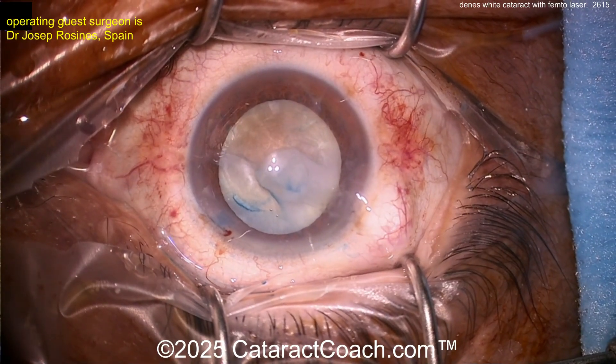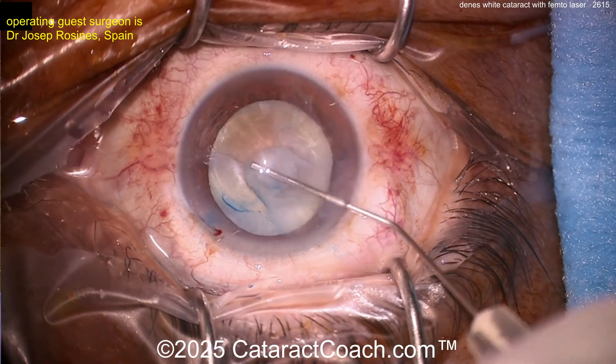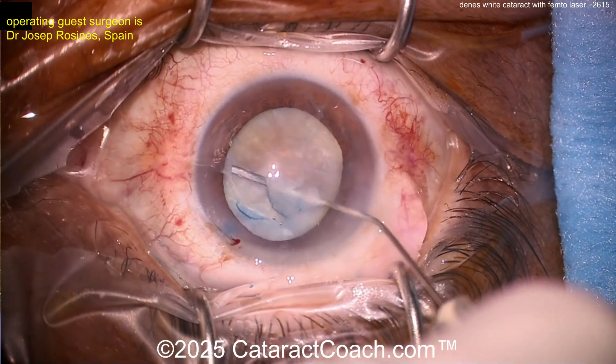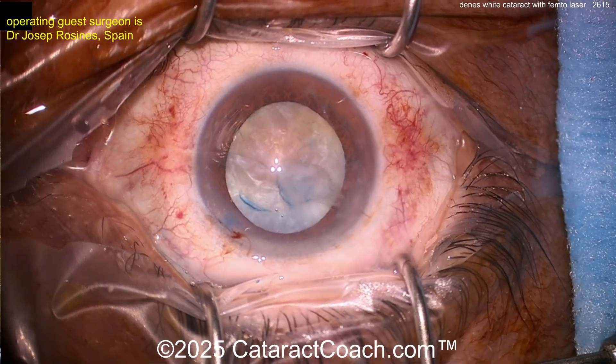Looks pretty reasonable. You can see a little more lens milk coming out of the capsule bag — that's liquefied lens cortex. On hydrodissection you'll be very cautious; you may not even need to do any, because most of the cortex has already been liquefied. You can already rotate as it is — there it is, it's already rotating.